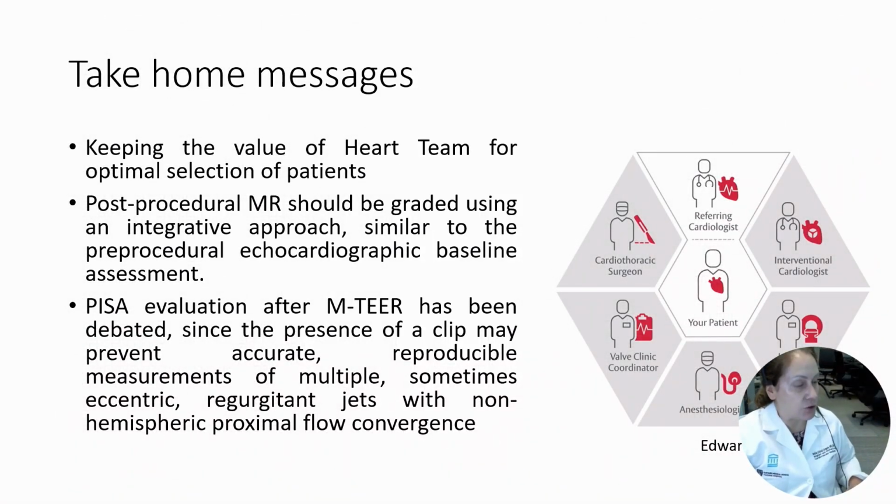Reaching the end of this lecture, an important take-home message is to keep the value of the heart team for optimal selection of patients. Post-procedural mitral regurgitation should be graded using an integrative approach similar to the pre-procedural echo baseline assessment. PISA evaluation has been debated, but now we have more advanced measurements such as 3D EROA, 3D vena contracta, and of course regurgitant volume, that are more comprehensive.